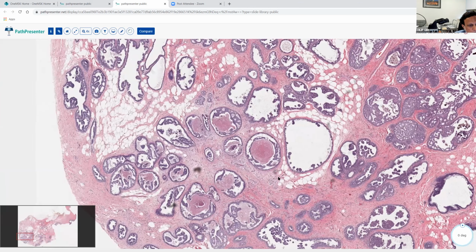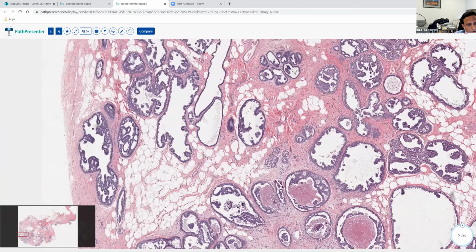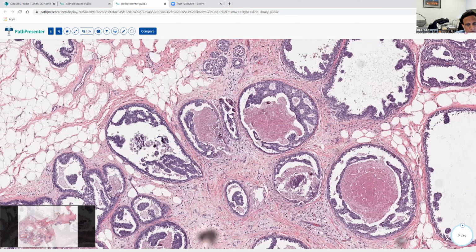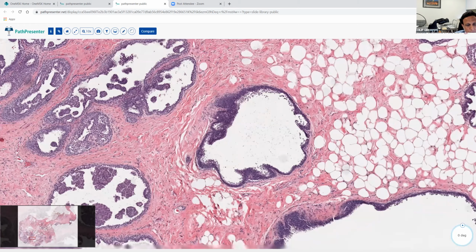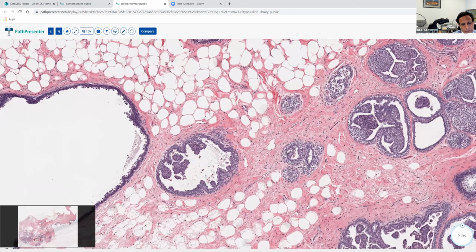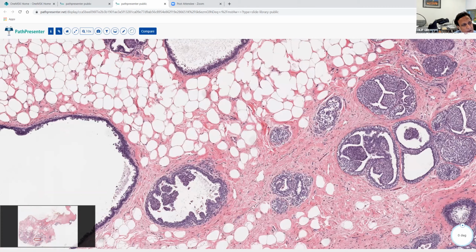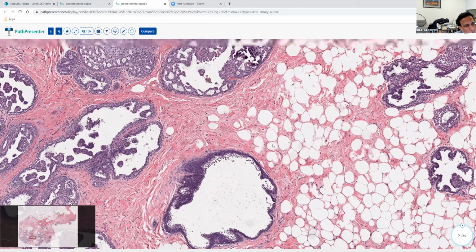And there are areas where it seems like it's pretty much almost exclusively ductal. And then there are areas where, so there is some kind of zonation. It's like a weather system, right? There is a cold front coming from here, and then there is a warm front. And somewhere they just kind of mix. So a nice example of collision.